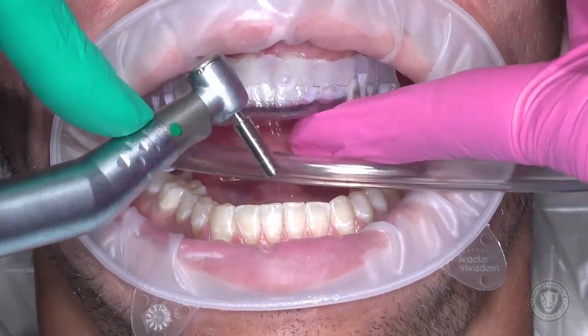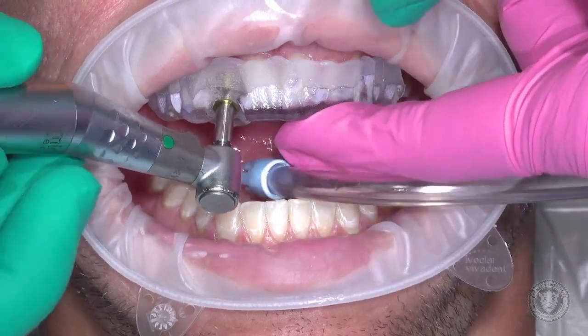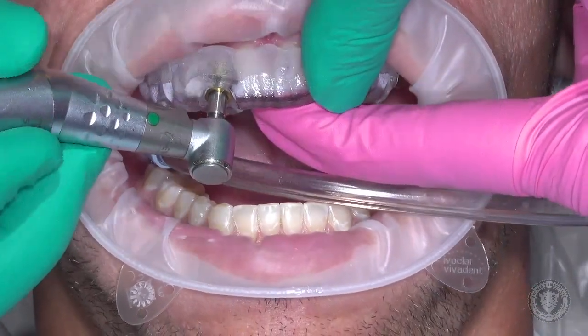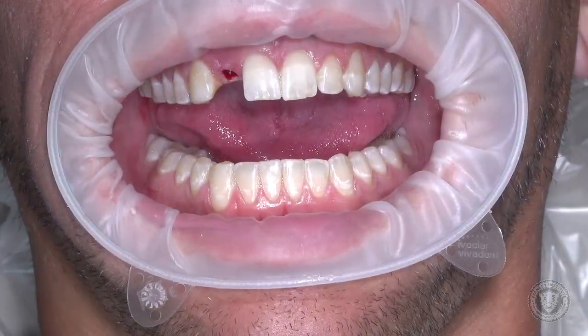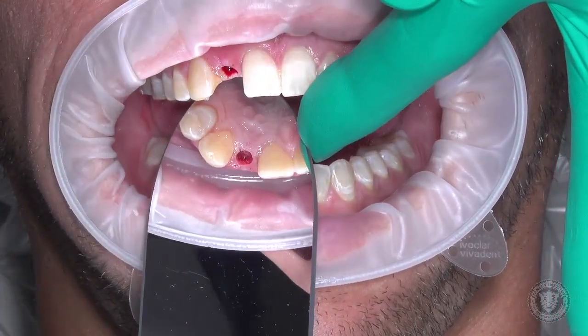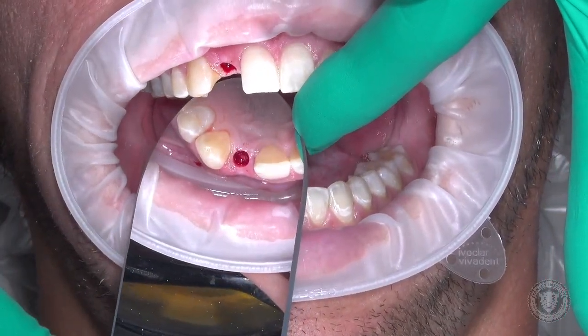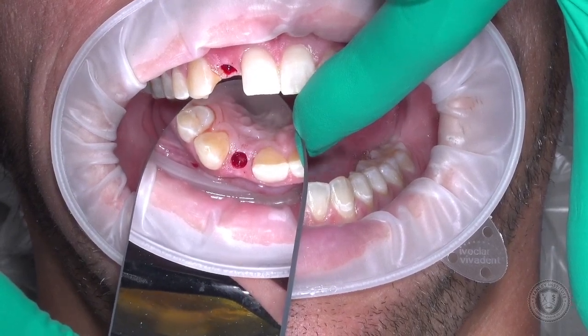This is our tissue punch. It's designed to specifically slide inside this master cylinder. As we slide into position here, we're going to go ahead and engage. We have a buccal defect, and we want to graft that. See that concavity there? That's what we want to build out so it's a little bit more flush.